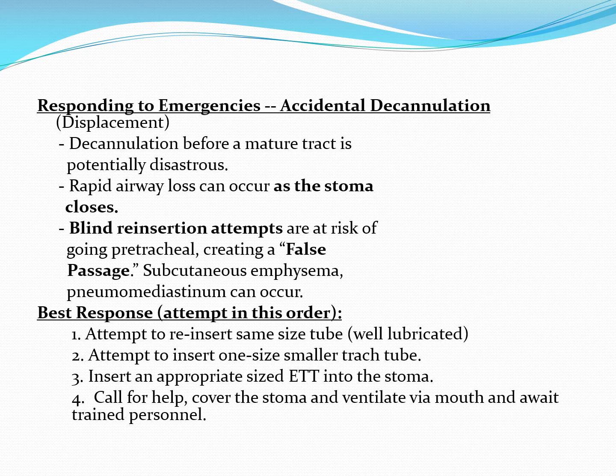But the tube that has just come out, it has natural lubricants on it. It has mucus on it. It's going to sound strange, but it's probably warm, so it's more pliable. It can most readily be put back in. Attempt to reinsert one size smaller.